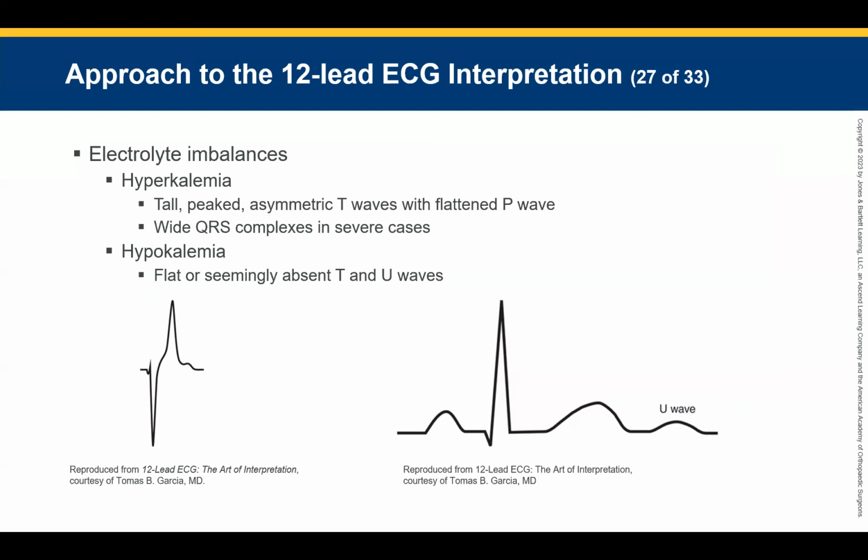Hyperkalemia, I believe that's one of our semi-mimics too. And then paced rhythms is our last. We've already covered paced rhythms, so I'm not going to go back and recover it. That's why I was asking if they matter, because hyperkalemia does matter. I'm not saying they don't matter. I'm saying they're not STEMIs, and we still have to treat our patient.